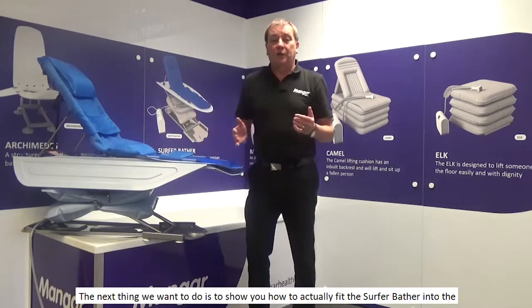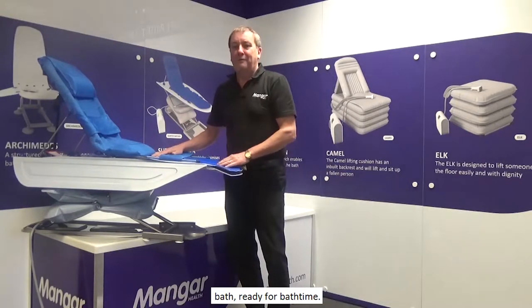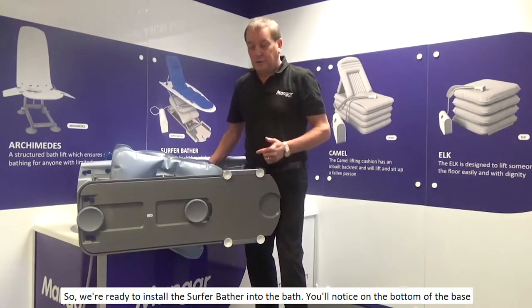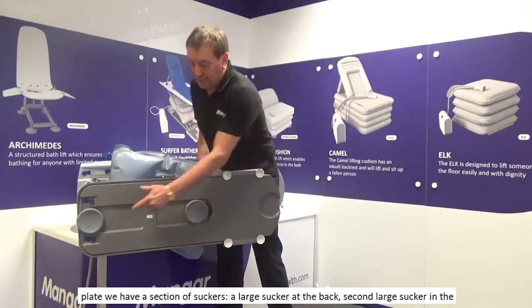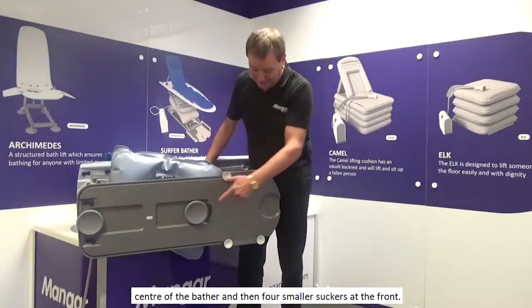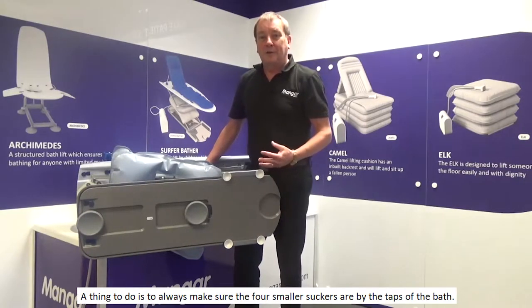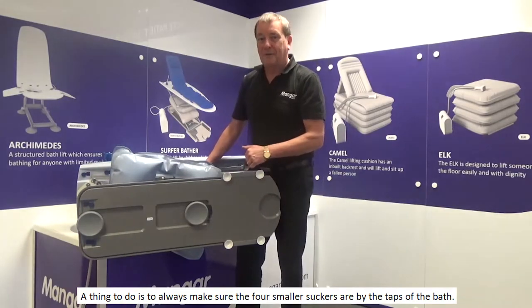The next thing we want to do is show you how to actually fit the Surfer Bather into the bath, ready for bath time. You'll notice on the bottom of the base plate we have a section of suckers — a large sucker at the back, a second large sucker in the centre of the bather, and then four smaller suckers at the front. Always make sure the four smaller suckers are by the taps of the bath.